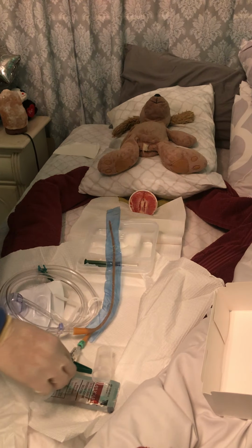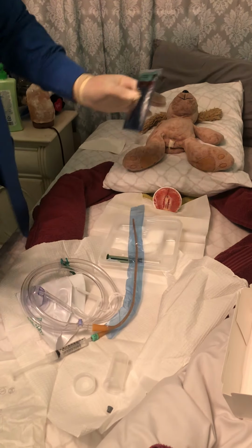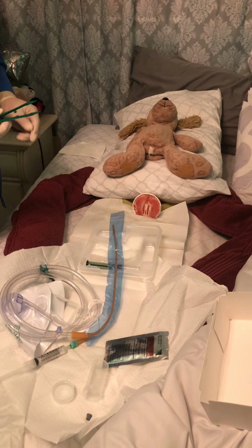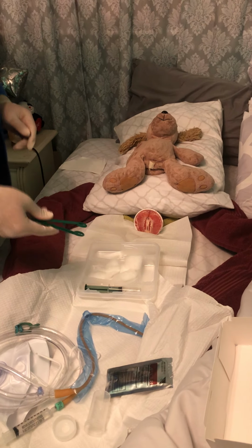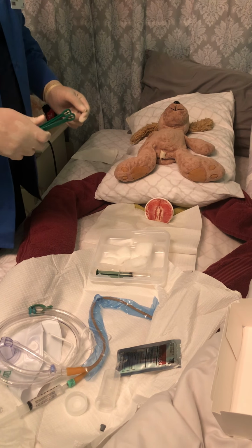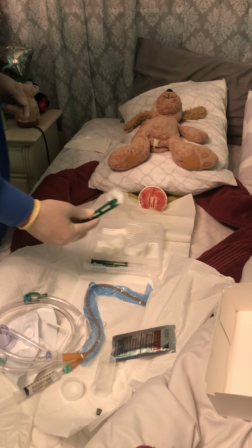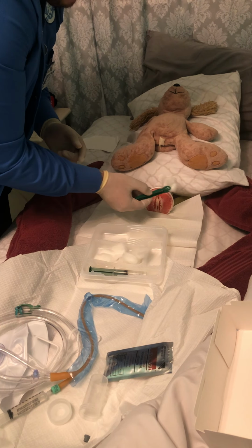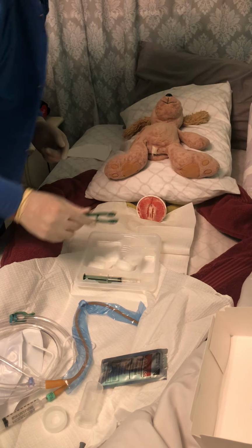All right. Before we go any further, so you would use the iodine, you would kind of place it in there. And with these, you would grab these cotton balls here. And with these, you want to basically, kind of the same concept with the washcloths. Always want to start furthest from you. And so we're going to start with the furthest. So you would wipe down like that. And then you would discard of it.